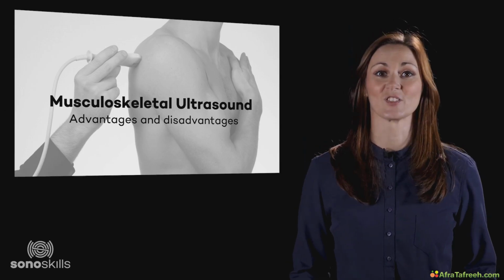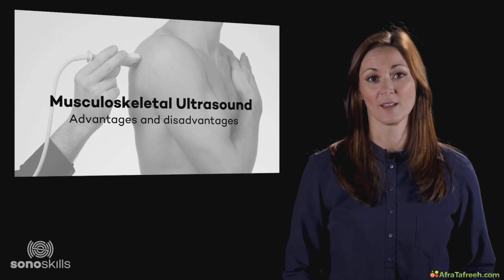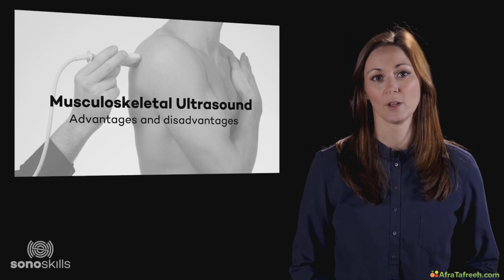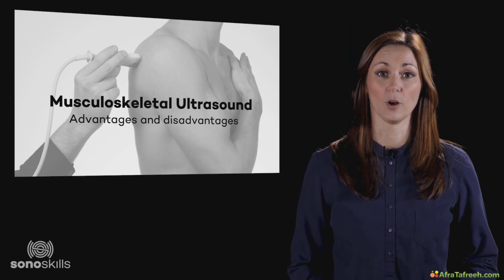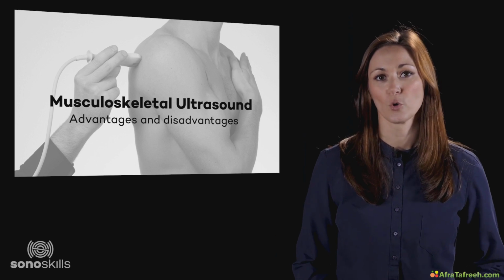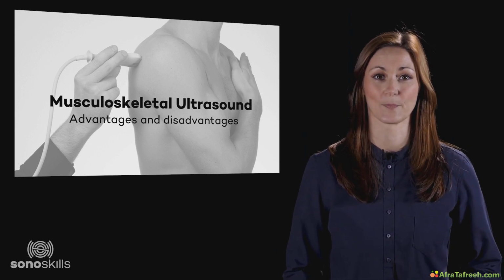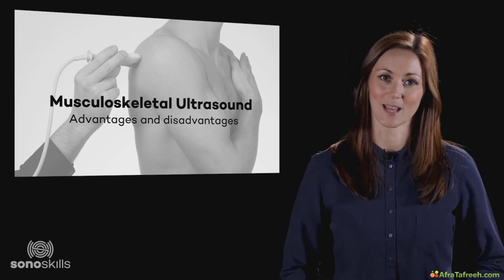The goal of this presentation is to compare ultrasound with other assessment techniques, such as MRI and arthroscopy. If we're going to assess the musculoskeletal system on a structural level, we can choose several medical imaging modalities, for example ultrasound, MRI, X-ray and CT. According to Tan et al. and many other articles, ultrasound and MRI are the most interesting techniques for the imaging of soft tissue structures. Let's have a look at the advantages and disadvantages of ultrasound and MRI.